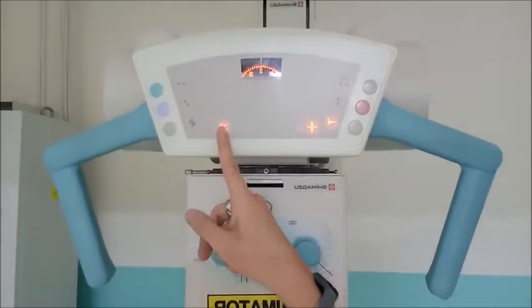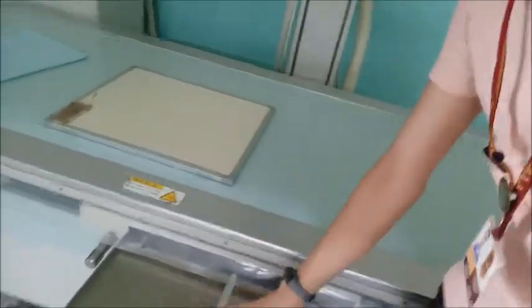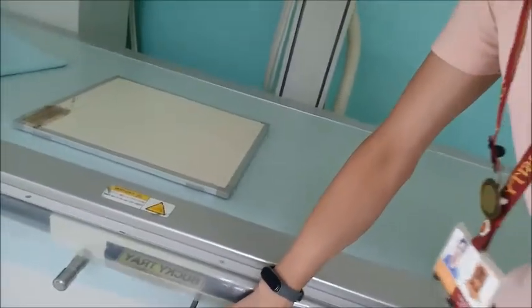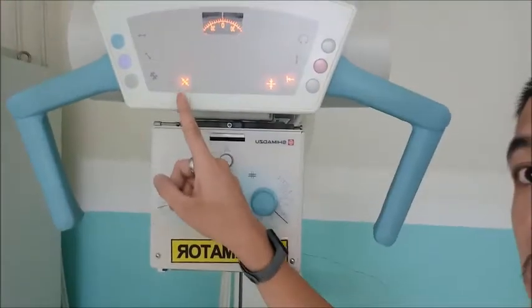That means if the light turns on, our tube is already at the center of the table, or the IR, if we insert it there. Okay, so that is already the center. Okay. So this is the vertical portion. So that's its purpose.